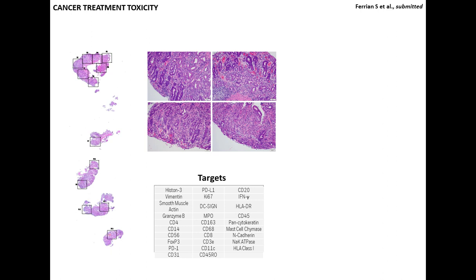We therefore analyzed the gastric specimen using an immunopanel comprising targets for T cells, B cells, regulatory T cells, NKs, and myeloid components. We also introduced targets to identify the non-immune compartment, such as endothelial cells, mesenchymal and epithelial cells, and finally, a few functional targets.